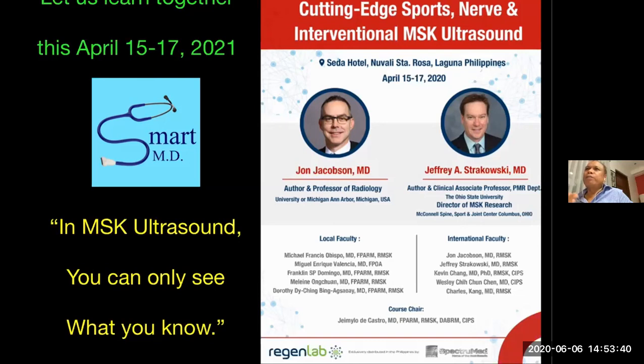So it is very important to put the target right in the middle in order to see the facet joint, and you can toggle or tilt it in order to see. Usually, if you are dealing with a degenerative disc in a patient who is more than maybe 40 or even 50 years old, you will already see some osteophyte formation.